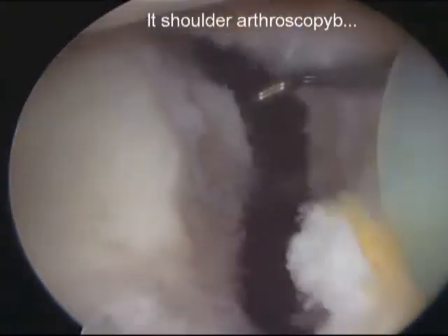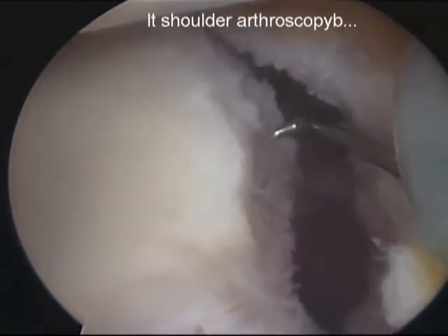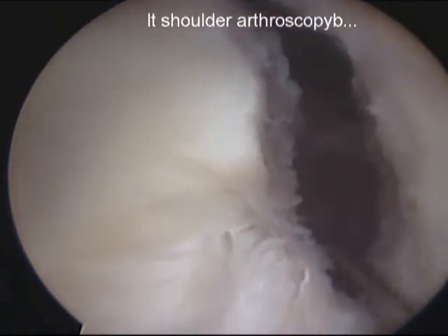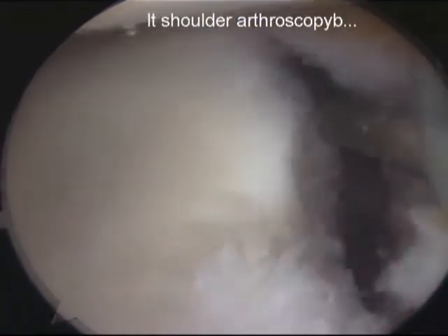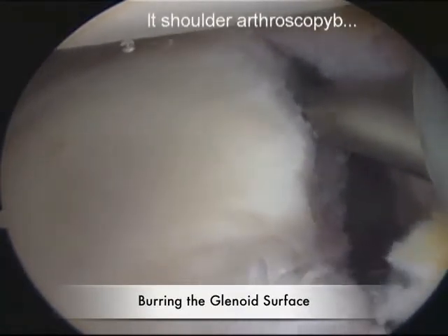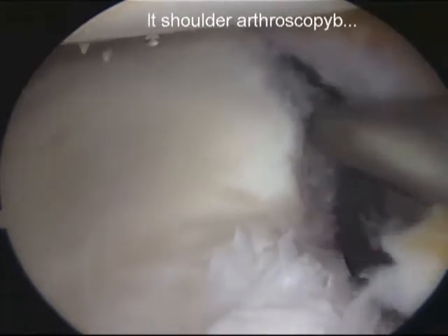The glenoid is also assessed for anchor placement and fragment reduction. A burr is then utilized to freshen up the bony surfaces in an effort to optimize healing.